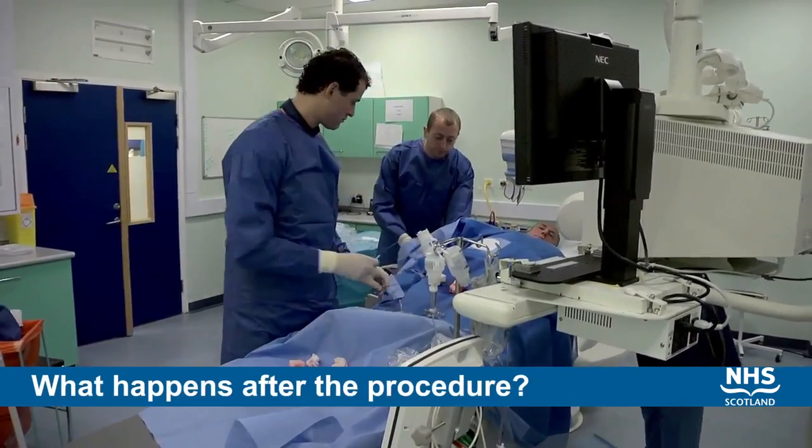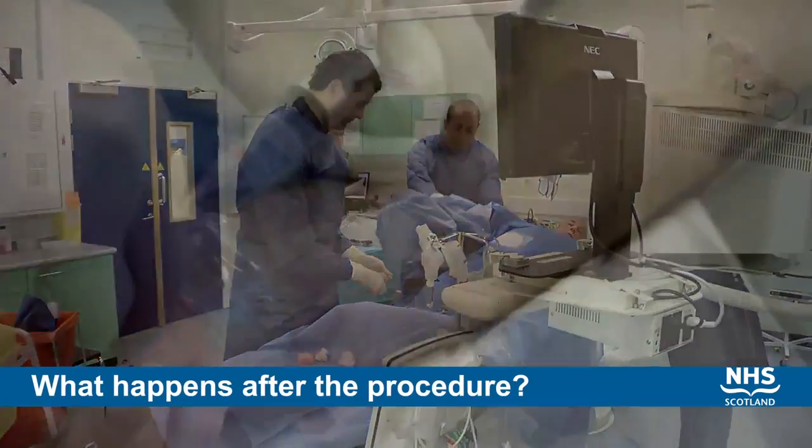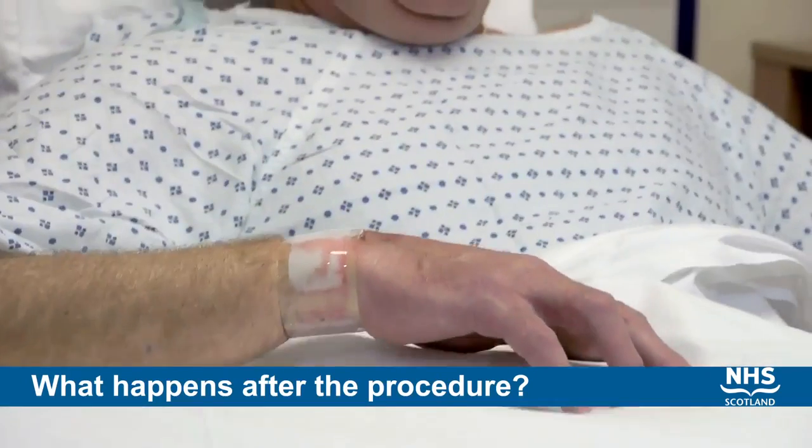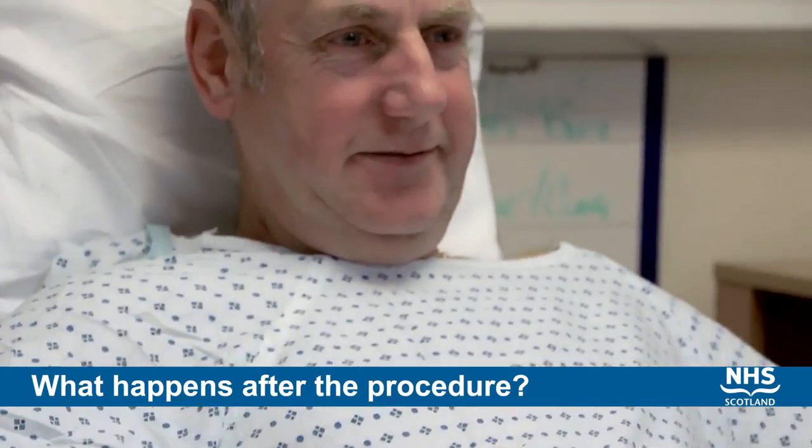After the procedure, the catheters are removed and a pressure bandage is applied over the wrist or at the top of the leg, and you're taken back to the recovery ward for observation. It is not uncommon to have slight discomfort at the site where the catheter enters, either at the wrist or the top of the leg, and very commonly there's minor bruising. Sometimes the bruising can be more severe, and this is why patients are observed after the procedure on the recovery ward to monitor for this.